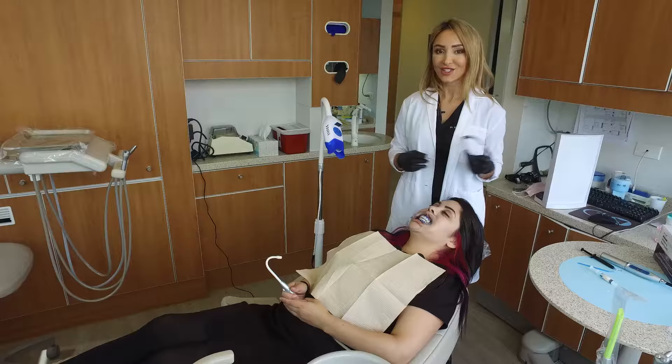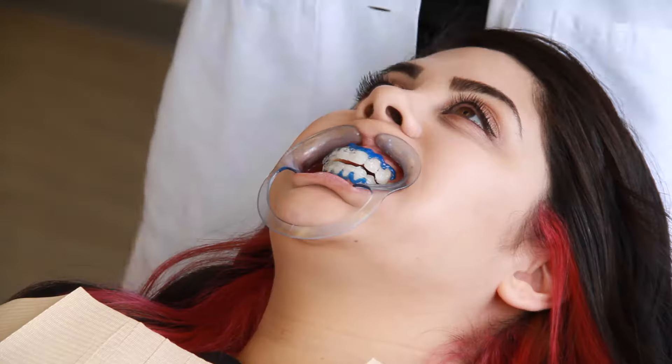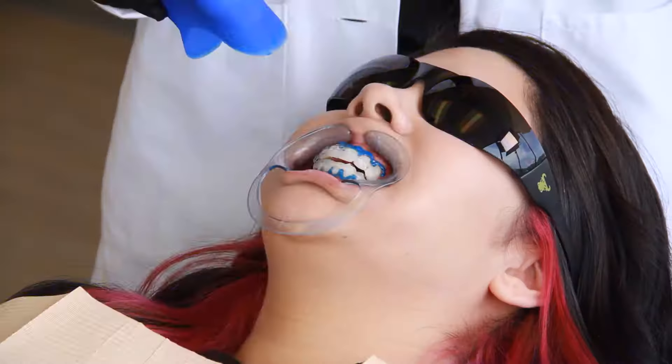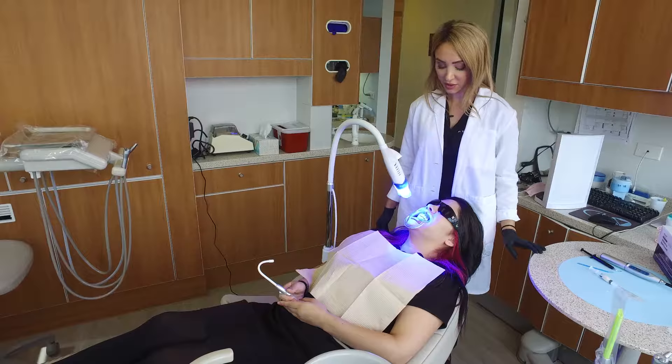Now we're going to bring over the light, but you've got to put these on your patients or else they get blinded by the UV light — it's like sitting in a tanning bed without the protective shield. And it actually doesn't tan you, so don't worry. Voila — we'll see you in an hour!